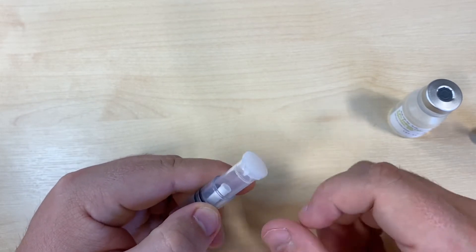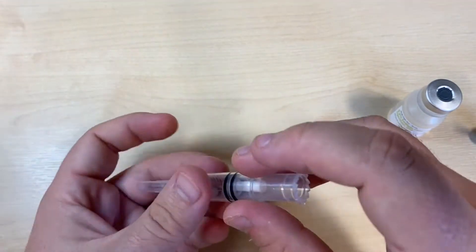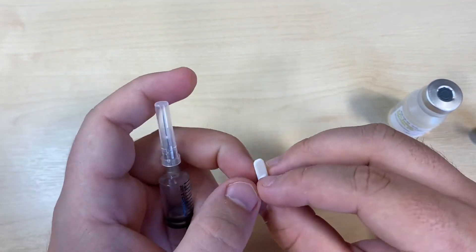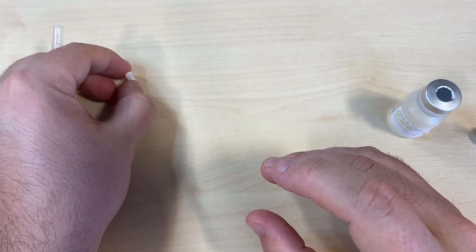There's a translucent cap on the base of the syringe that you can remove and dispose of. Inside the syringe, there's a small white cartridge cover. Keep that to one side, as it will be useful later.